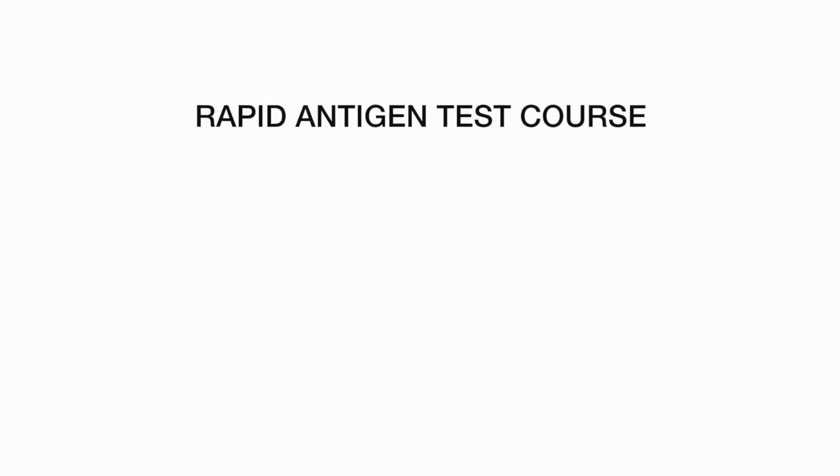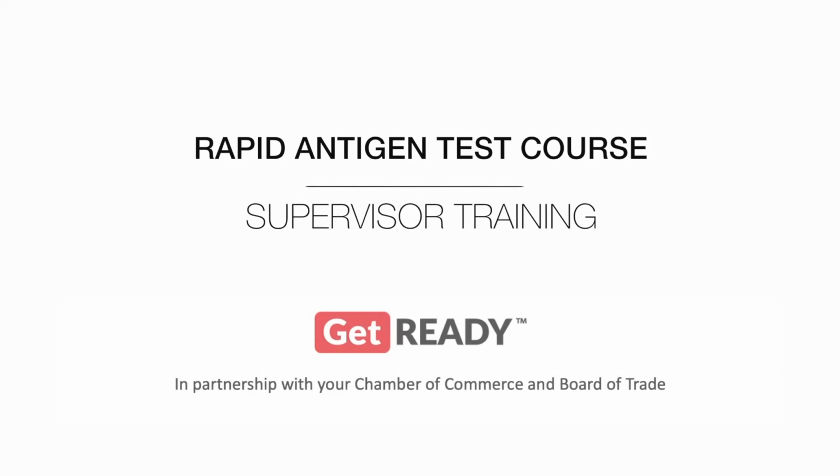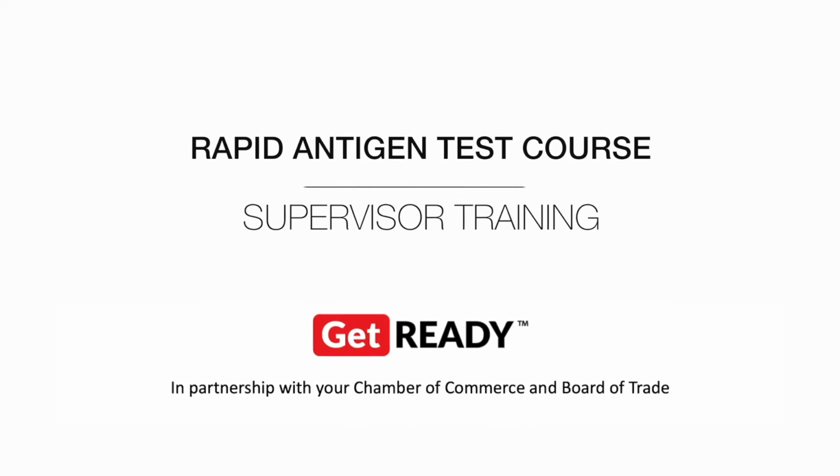Welcome to the Rapid Antigen Test course, Supervisor Training. These rapid antigen tests do not require medical professionals, such as nurses, to administer. It is a simple skill for employees to self-collect a specimen by swabbing their nostrils.